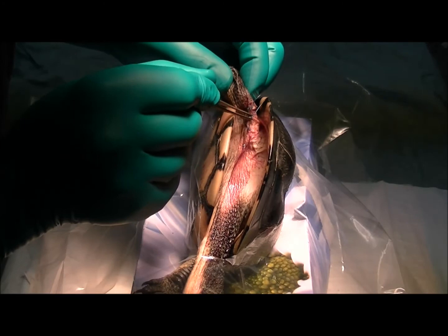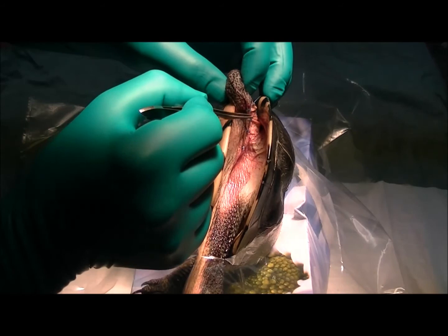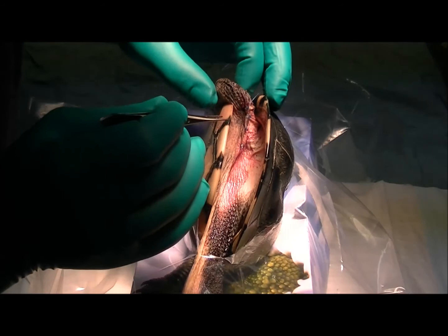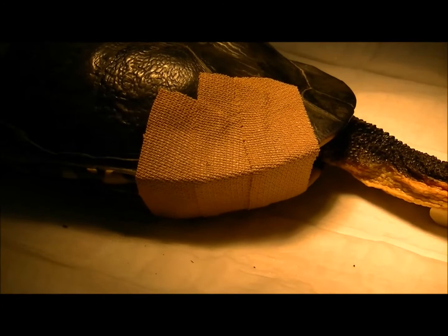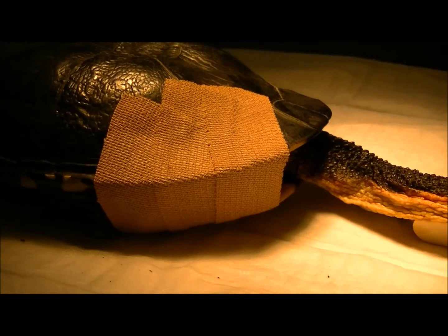I've stitched up the skin — four little stitches to get that all back together. The plan with this turtle now is we'll wake her up and in the next day or two we'll induce her to lay those eggs, incubate them, and keep her in hospital for a few more days to make sure she's getting around okay. Then we'll send her off to one of the wildlife carers who will look after her for the next six weeks until we get these stitches out, and hopefully we can get her released back out into the world. We've placed a small bandage over this area to hold that leg so she can't use it, which will aid the healing process.